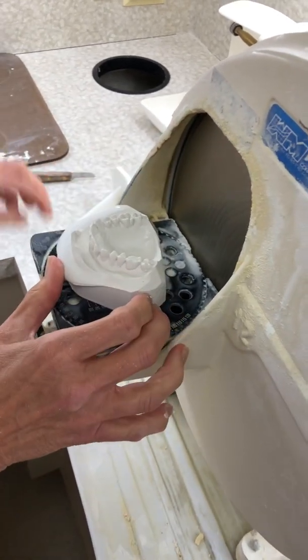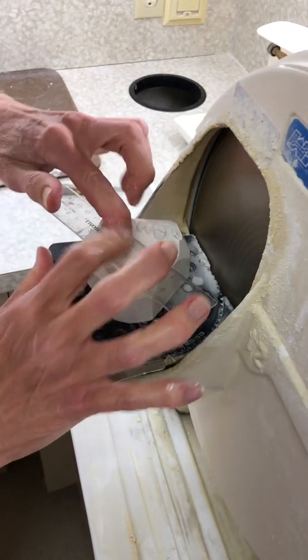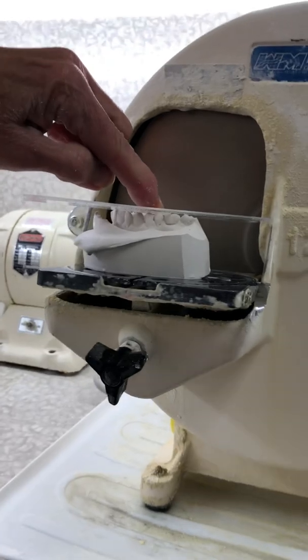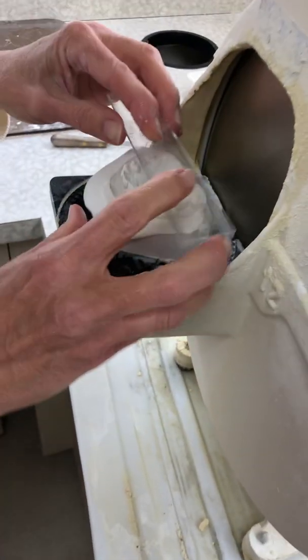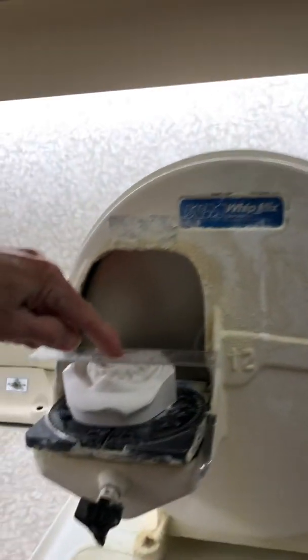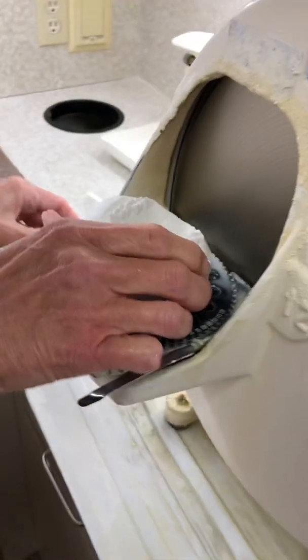So you've got it. The easiest way to check if you've got it level is to go down and hold it like this and then just look at the level to see what you've got. And that actually looks pretty good. The other way you want to check it is this way, and you want to make sure that you've got it this way as well. Okay, so that looks pretty good.